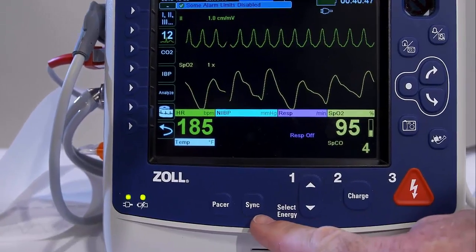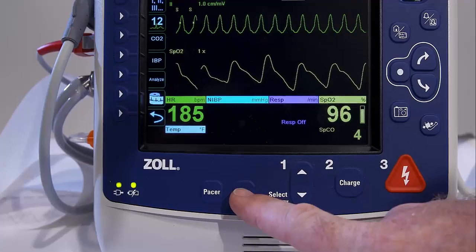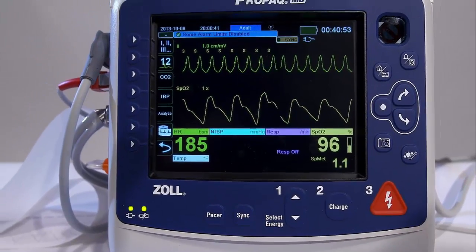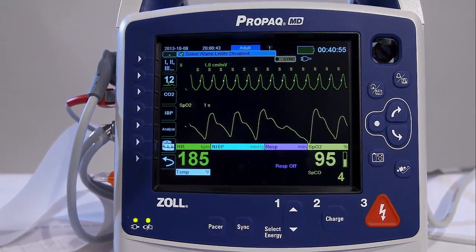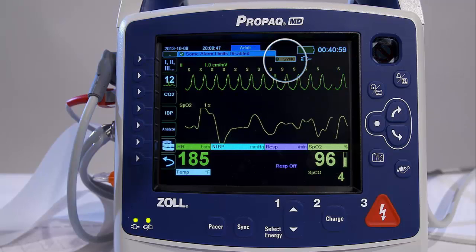Press the Sync button on the lower front panel to place the ProPak in Sync mode. A Sync indicator appears at the top of the display screen, and a green light next to the indicator flashes with each Sync marker.